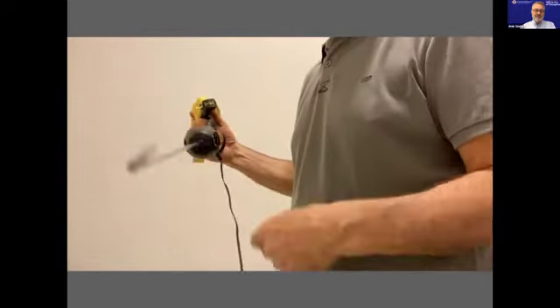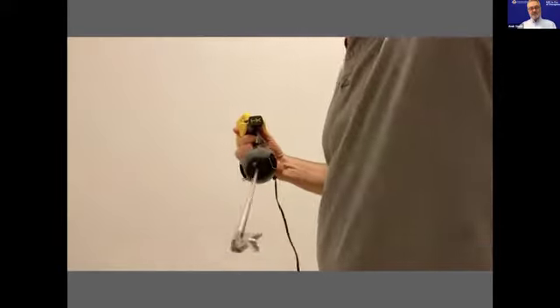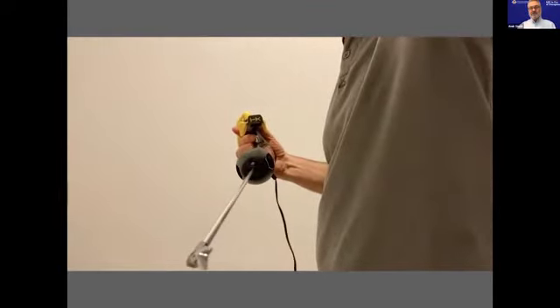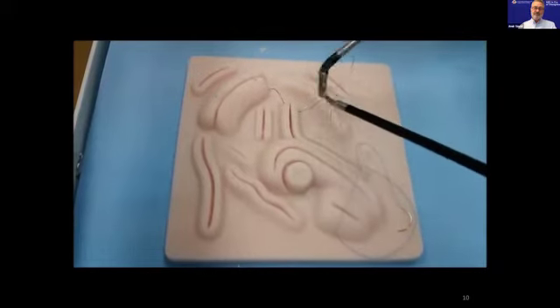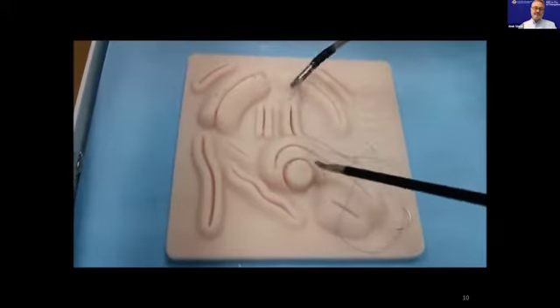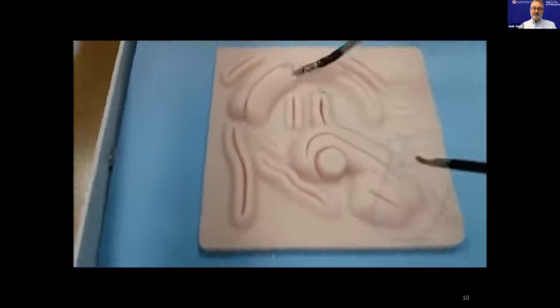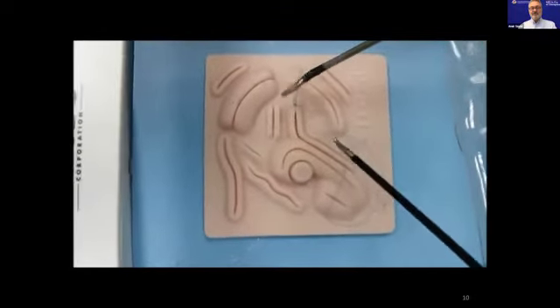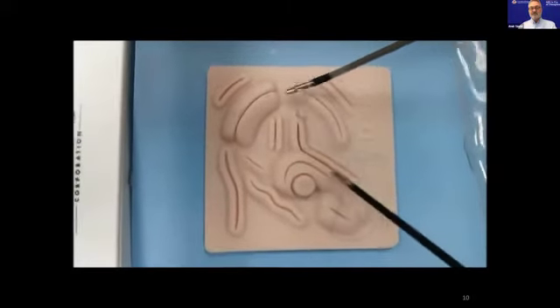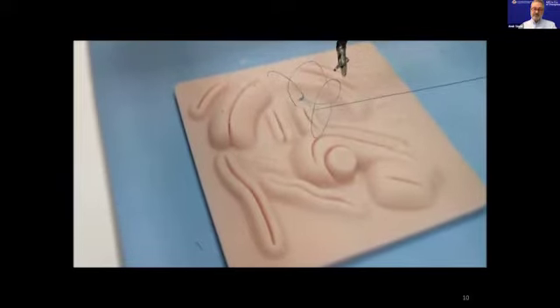And you can rigidize it: you can double click, and then it becomes a rigid instrument at an angle. You can limit the motion to create a less jumpy instrument and allow surgeons a short learning curve. And you can really perform nicely in difficult angles, suturing and knot tying very beautifully. Currently there is a needle holder, and the tips of the instrument are replaceable, so you can use a needle holder, scissors, grasper, hook, whatever is common. You can see you can suture towards you and away from you, and it's really nice.